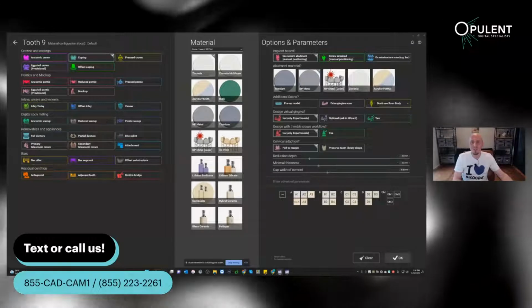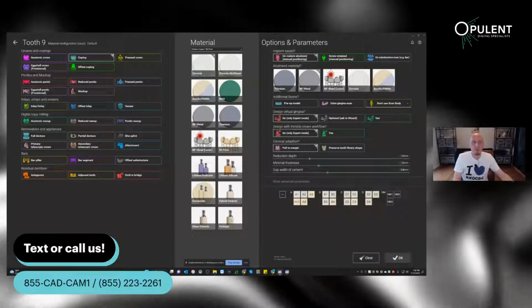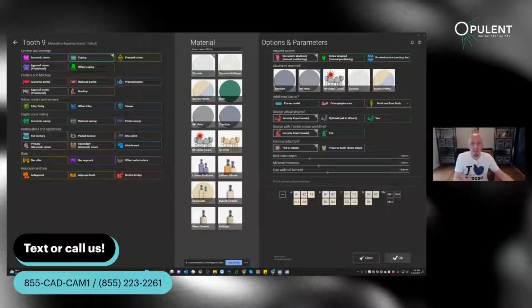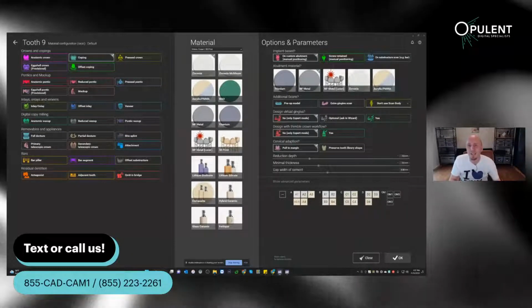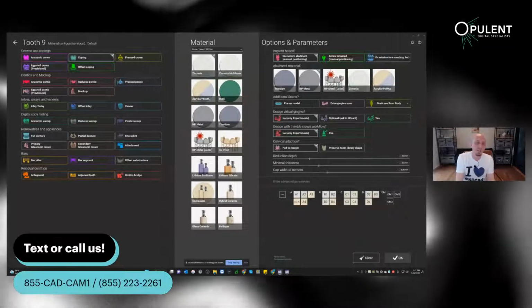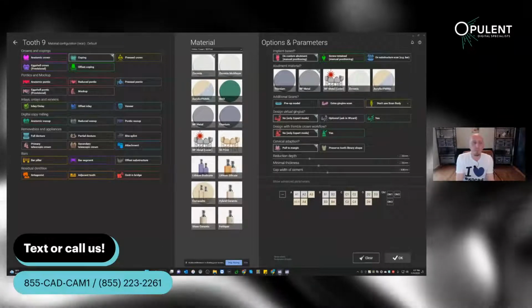I'm stuck here and there. Do you know, you do those implants all the time, right? Yeah, I got a library for you. Where do you get it from? I got it from the rep somehow, and it's an unofficial version, but it comes from them, and it's sometimes a little messy. And I guess that's exactly the point why Exocad is trying to make this all a little easier and streamline this. It's not the norm, but it will possibly happen too.